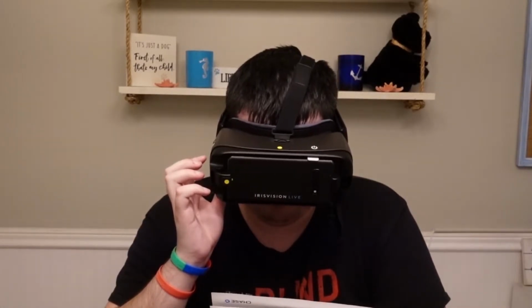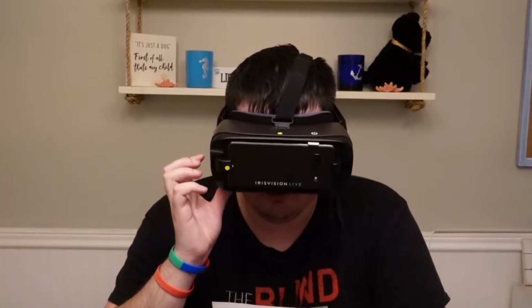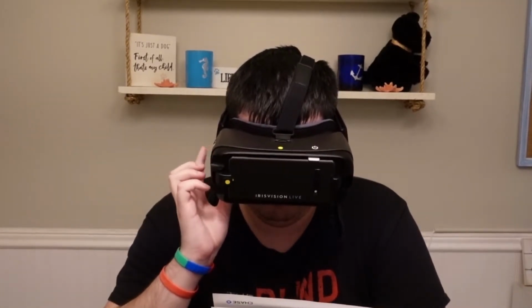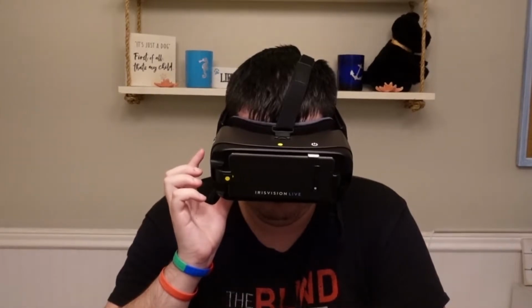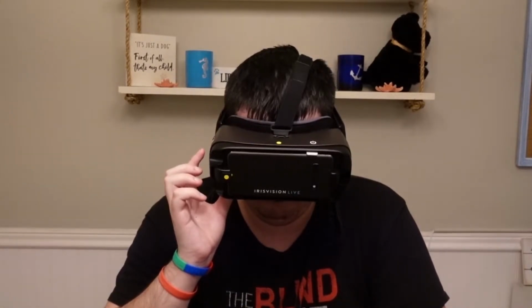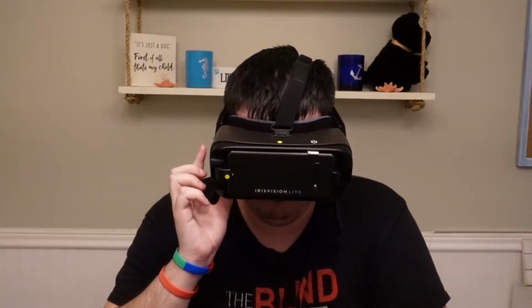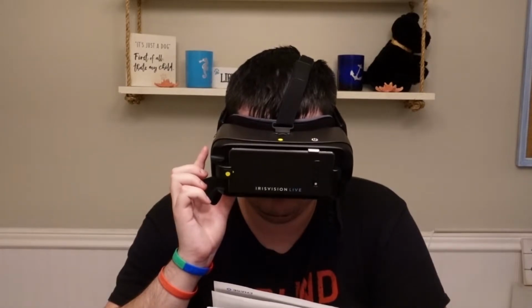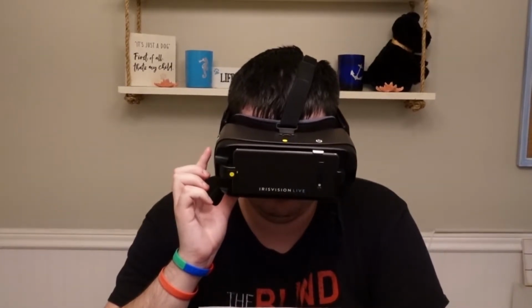I was playing around with the size of the line. You can really make that big if you want to, and then try adjusting the size of the window to isolate one line or two lines of text. This prevents common reading mistakes such as reading the same line twice, which I am prone to do, and I don't have any visual impairment.